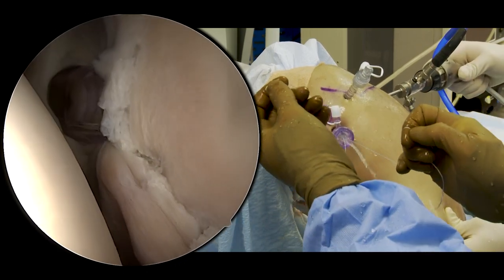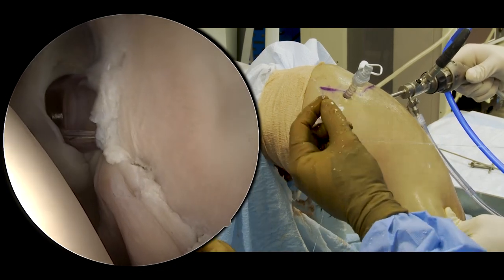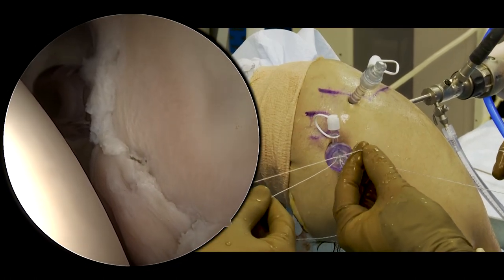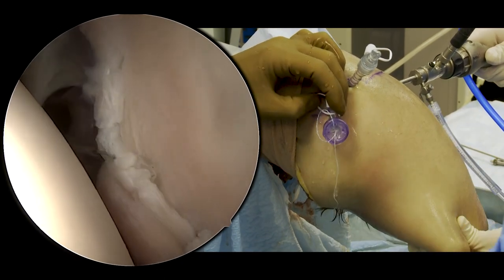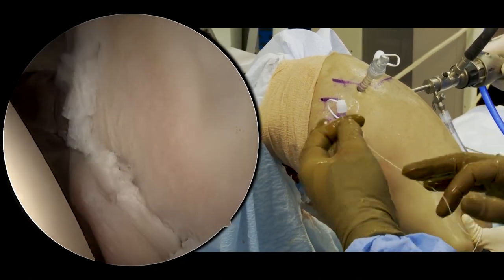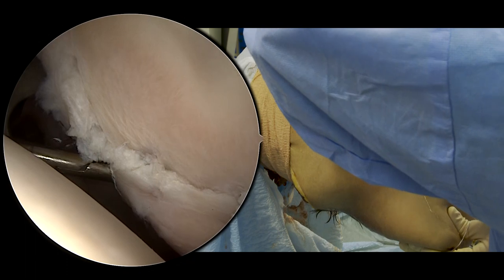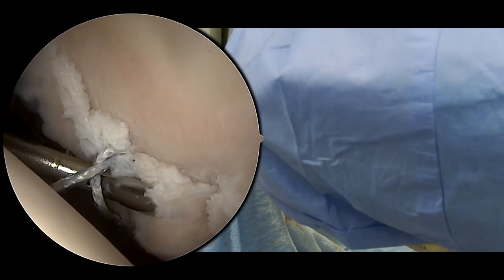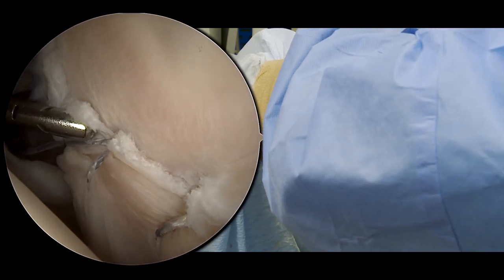With the shuttling suture, I just give that a few pulls to make sure that it slides really nicely, as you see here. Then I hold up the looped end so that we can shuttle that repair suture back through the locking mechanism in the anchor. He's going to fold it and hold it, and then we're going to pull this through. At this point we will tension it. As we come to that final position, I can actually stick this micrograsper inside that loop that we're creating, grab the tissue down below, and then tension it to get a little bit more of a shift up onto the face.